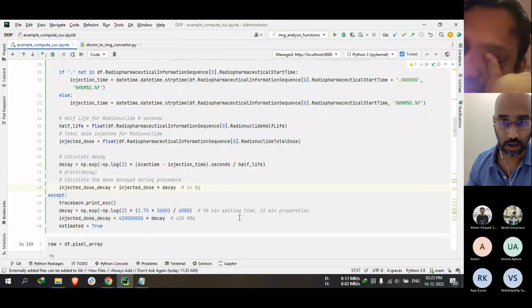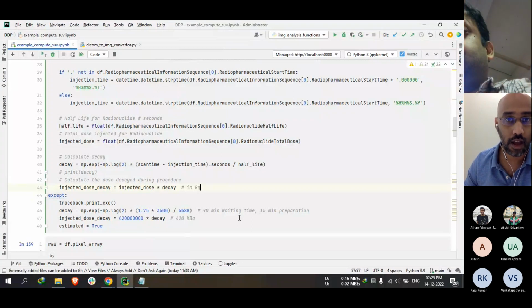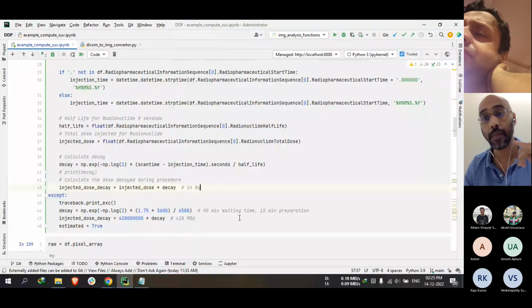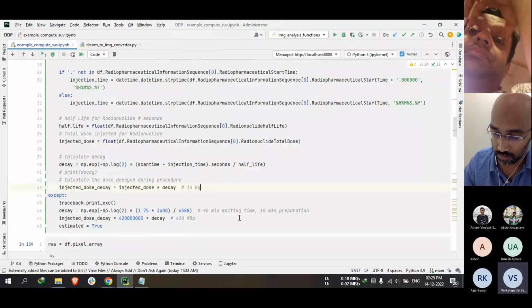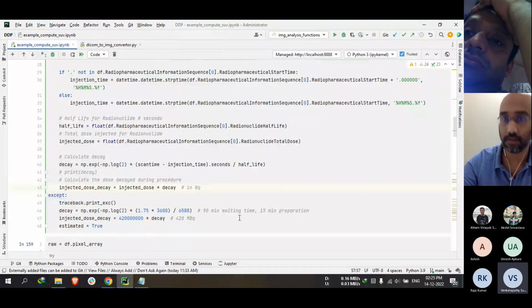Yes. Venkat, do you have any inputs on this? So I am thinking that the next job is to find in which specific organ the metastasis is, or in which specific organ we see the highest SUV levels. Venkat, before that, do you see any intermediate steps that need to be done? No, not before that, but where the sphere will come in is there will be a conflict of SUV between organs and metastasis. The sphere labeling functions will tell us what the difference would be.